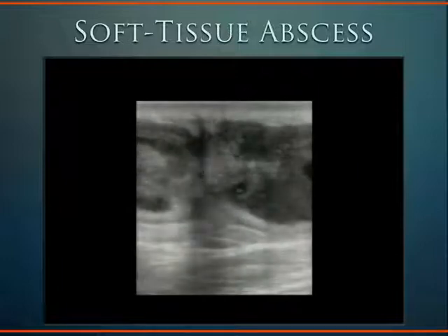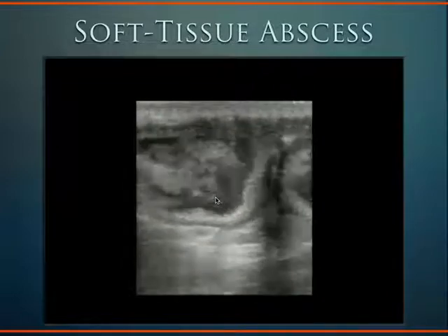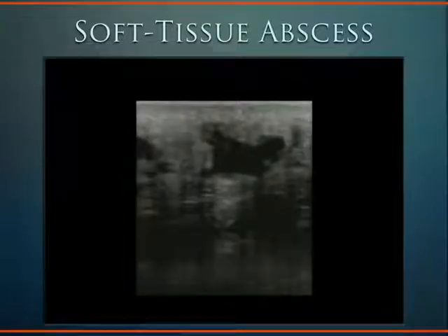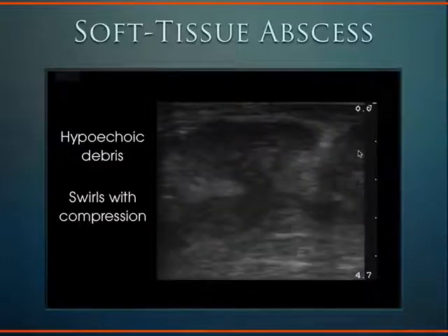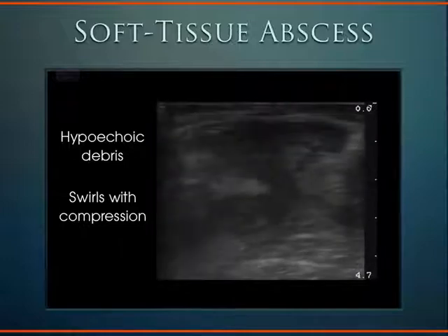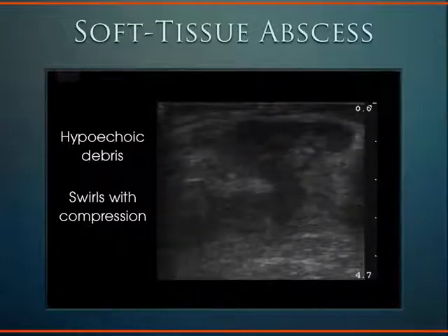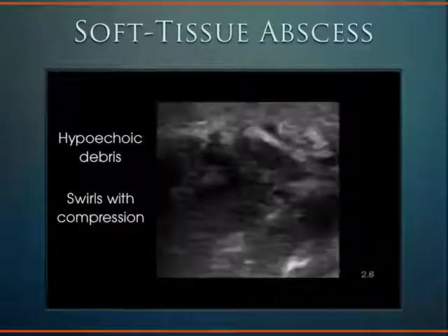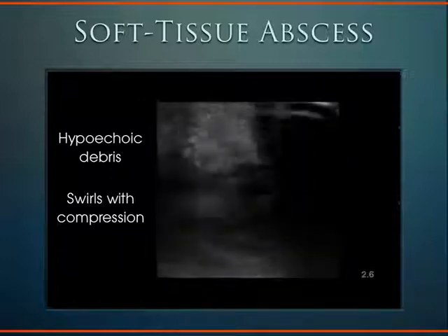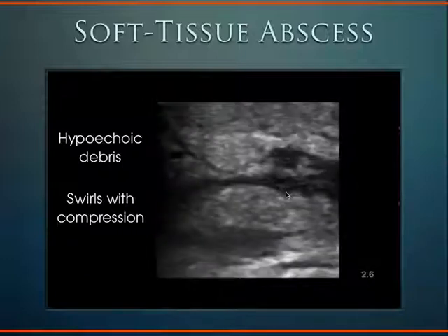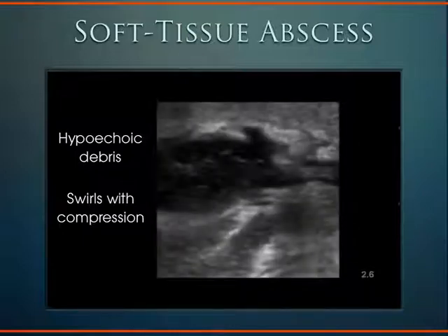Here's an abscess — we can see this hypoechoic debris layering out. This is what pus looks like. If we compress this area, we'll see the hypoechoic debris swirling around. Here's another example where on compression we can see swirling hypoechoic debris, sometimes connecting with other abscesses. Occasionally these abscesses are so large they can't be drained at the bedside and require drainage in the operating room under full anesthesia. Sometimes you'll see cobblestoning on top with abscess underneath; other times just abscess without any subcutaneous cobblestoning.